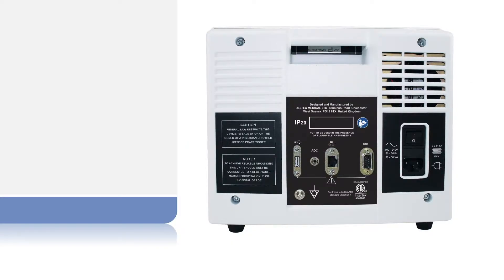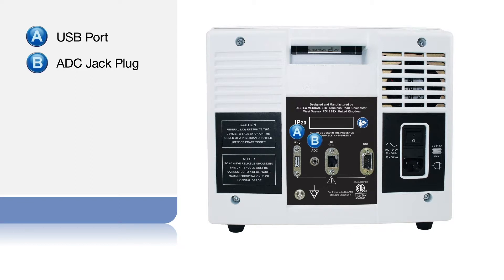This video walks you through the EDM Plus and its controls. Located on the back of the monitor, working from left to right, are a USB port for downloading patient data, and a round jack socket labeled ADC which relays the arterial blood pressure measurement from the patient monitor.